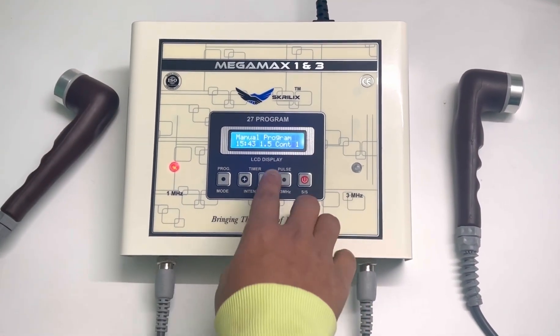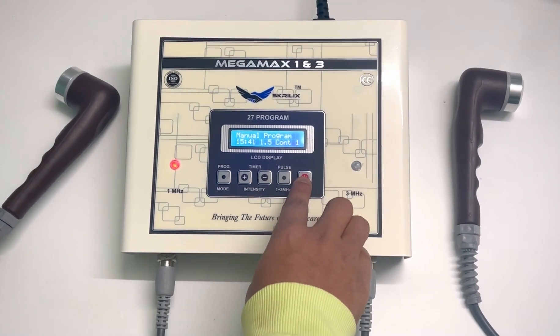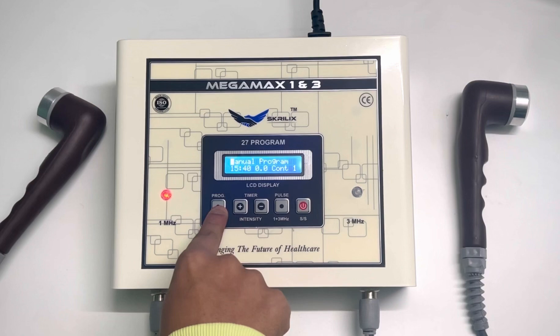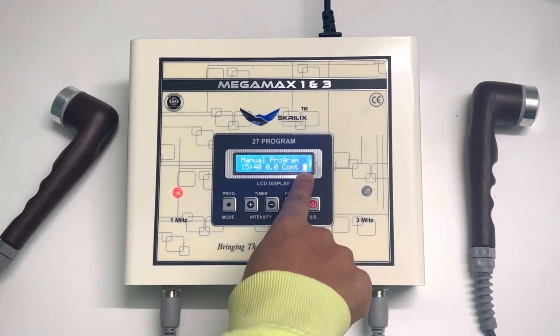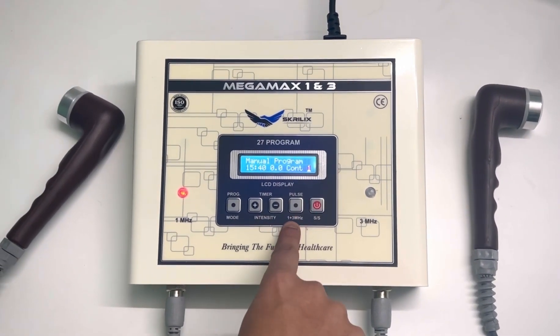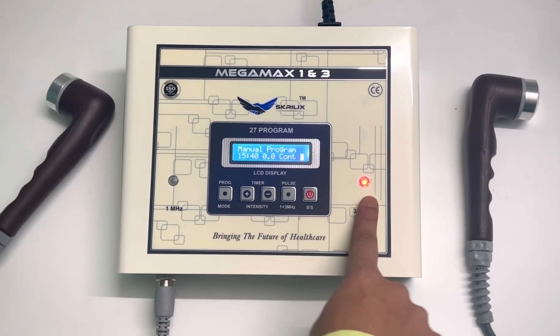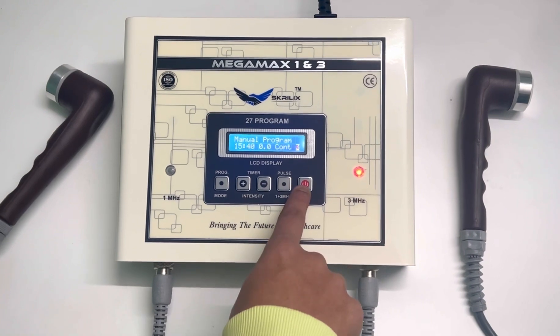Now if you want to switch to 3 MHz, press the start button. Press this button again, and when the 1 MHz starts blinking, press the 1+3 MHz button. As you can see, it switches to 3 MHz. Now press the start button to use it on 3 MHz.